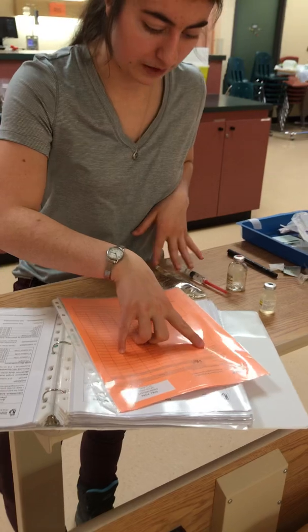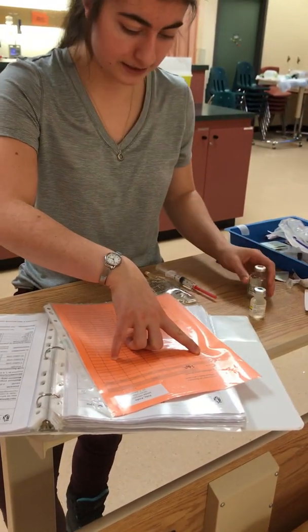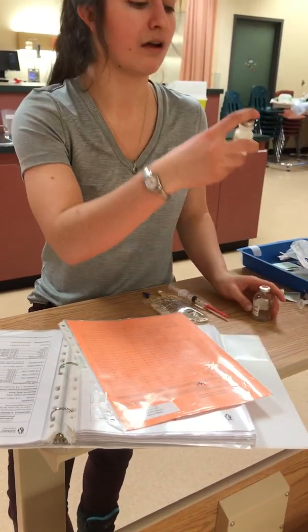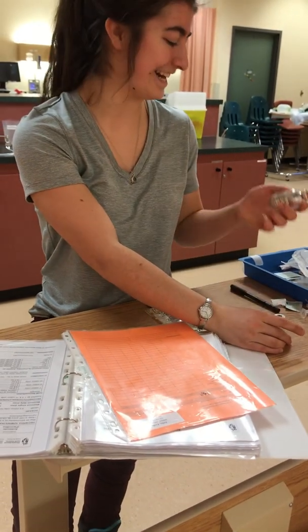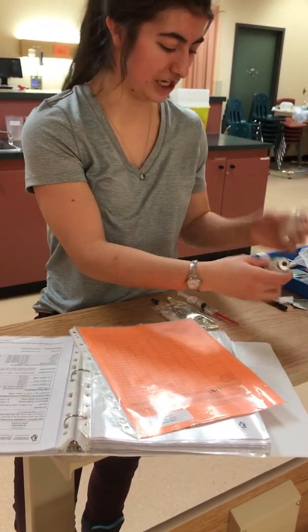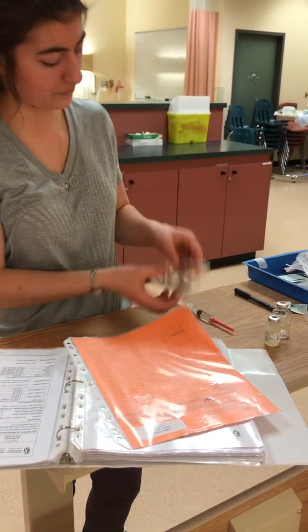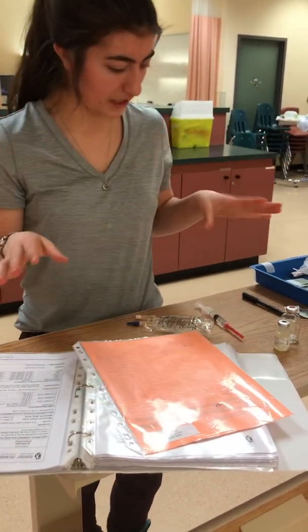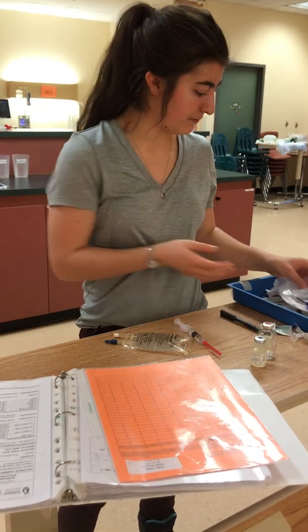This is prepared for, or in the process of being prepared for, an IV injection, which it is, and it is every 4 hours, which is the correct time. I'm checking that I did put normal saline in there and my penicillin G. So I have the correct things reconstituted, put in here, and I have my normal saline prepared for the final shebang.